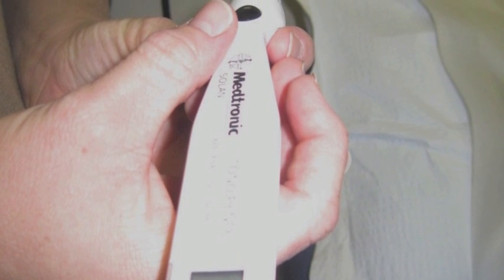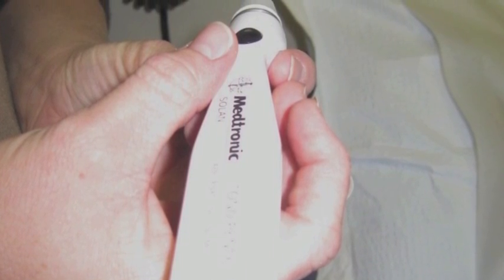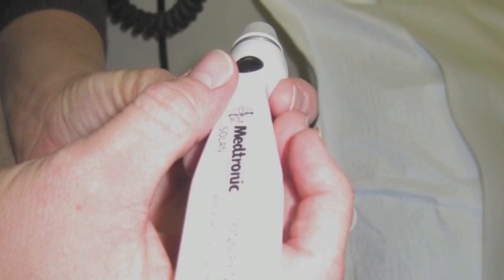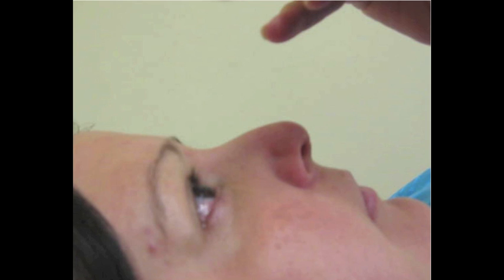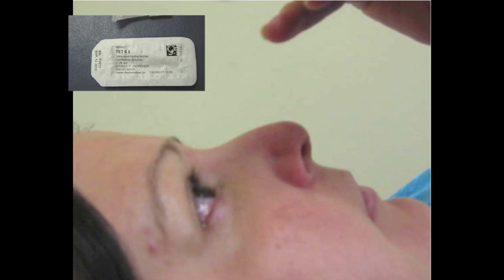This video will focus on the electronic portable tonometer, which is currently the most commonly used in family medicine practice and urgent care. Clearly explain the procedure, its indications and risks to the patient. Apply one or two drops of anesthetic solution, such as tetracaine, in the eye.